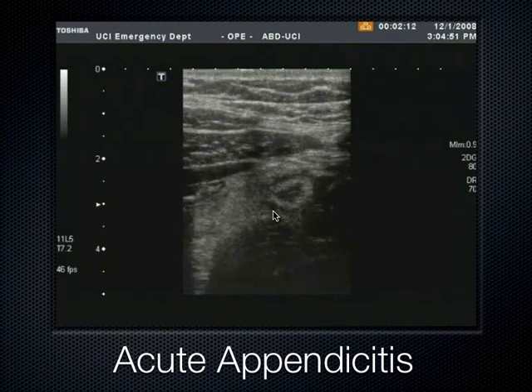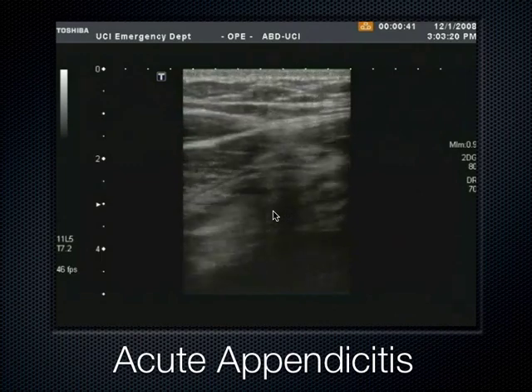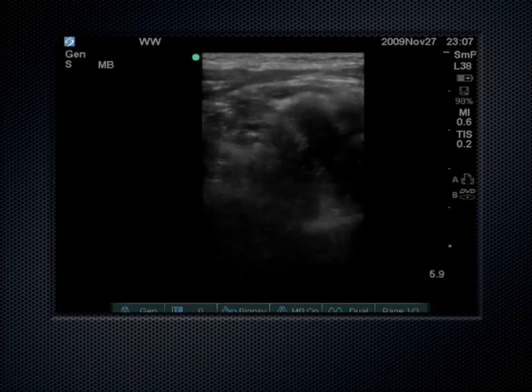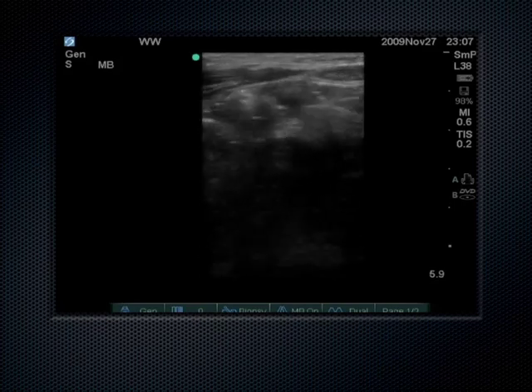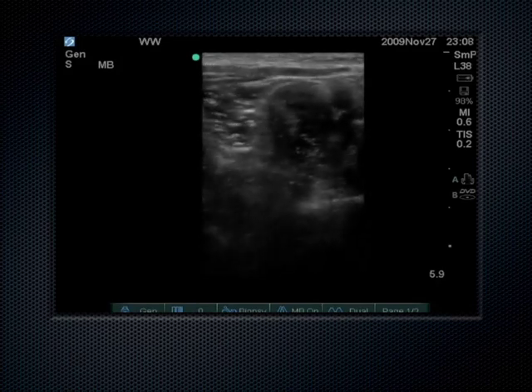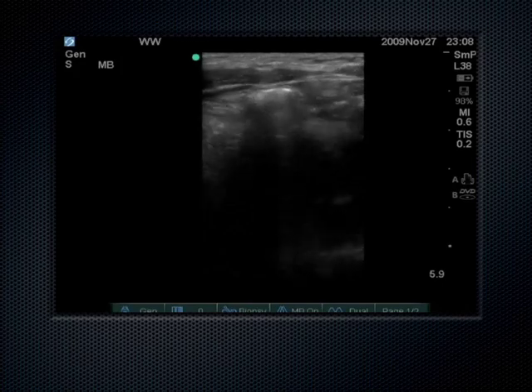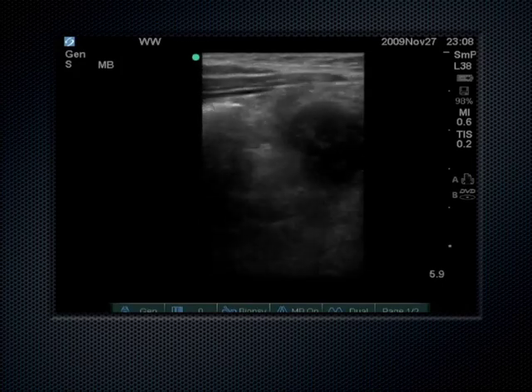And the patient lets you know too that you found their appendicitis in a very clear way as you're doing this. Sonographic McBurney's sign is what some people call this. Sonographic Murphy sign is for the gallstones. McBurney's sign is what some people call this, because McBurney's point is the location where the appendix usually lies in the right lower quadrant, which I know you guys have been studying.